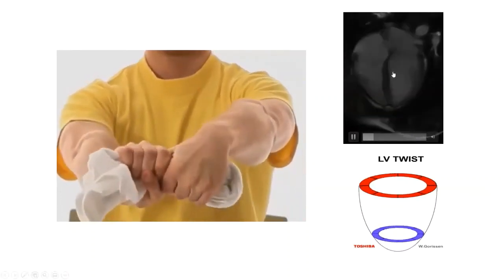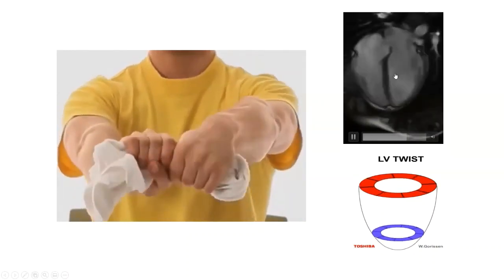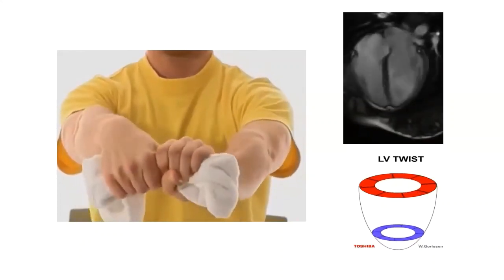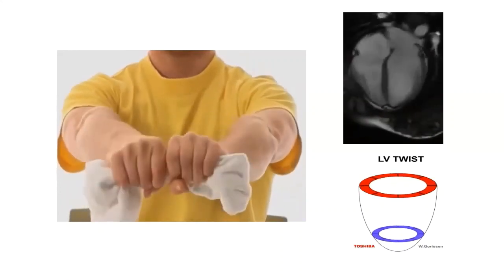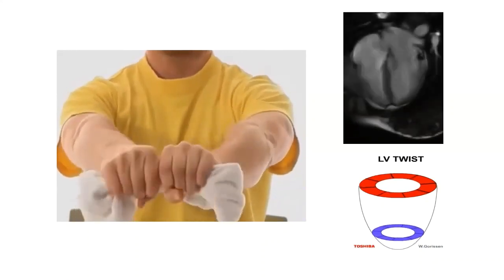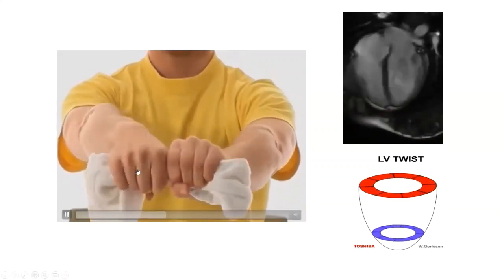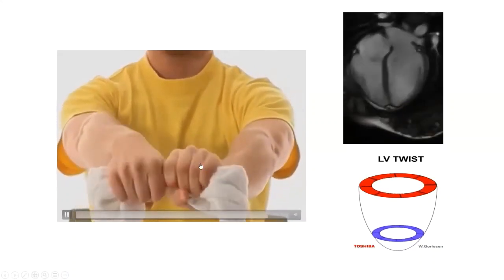And I think I was fixated for many years on just the systolic motion where the walls come together and generate the stroke volume. Because of advances in imaging, notably cardiac MRI, tissue Doppler, and strain imaging, we know that what is really happening is a three-dimensional activity. And I use this video here to illustrate what's going on.